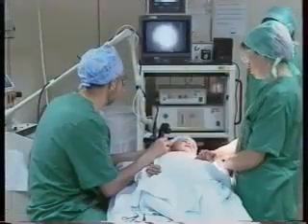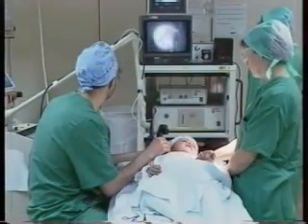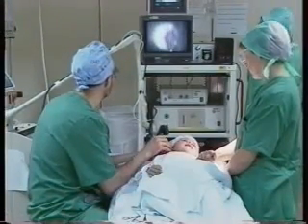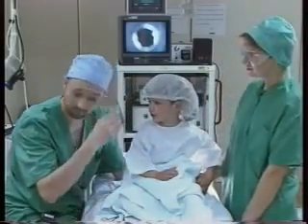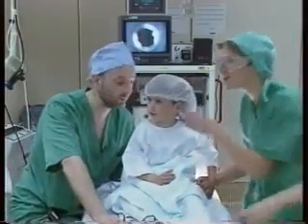Literature reports a success rate between 40 and 64% for tympanic membrane fenestration in children and between 60 and 84% in adults. We believe that CO2 laser-assisted tympanic membrane fenestration should be initially attempted when the patient's age permits cooperation during surgery under topical anesthesia.